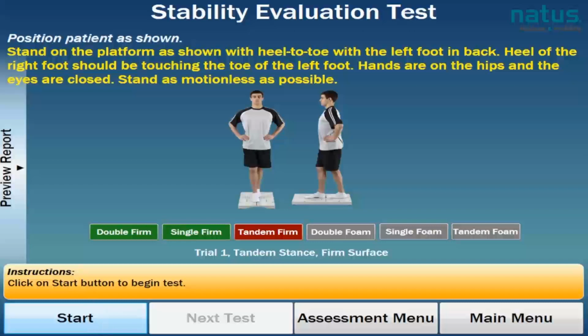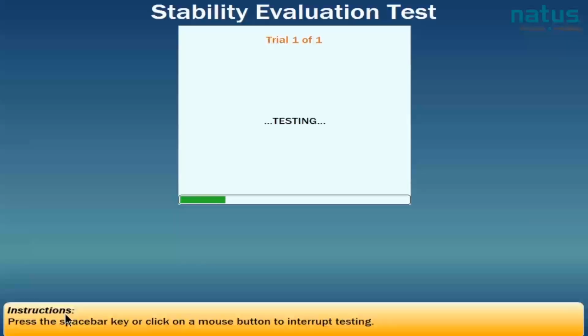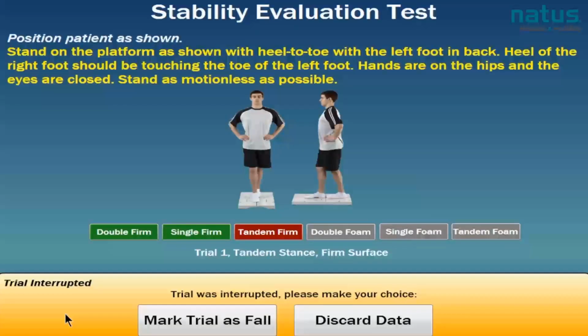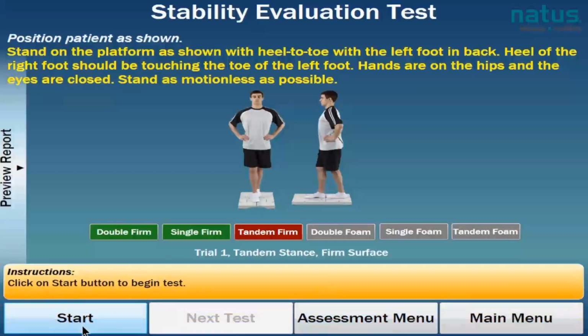We're going to go ahead and run the test. Are you ready? Ready. When you're ready, close your eyes. And I start the test. It's a 20-second trial. I'm making sure he's safe. If you feel unsteady, just open your eyes. And he's making adjustments. And he opened his eyes. So I'm going to, again, discard this data and give him one more trial.